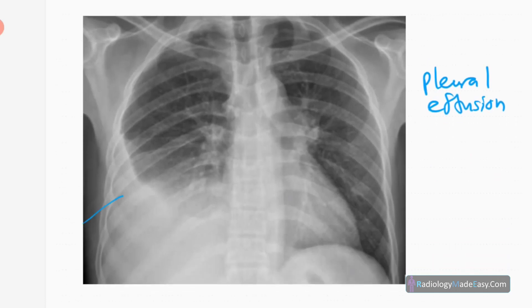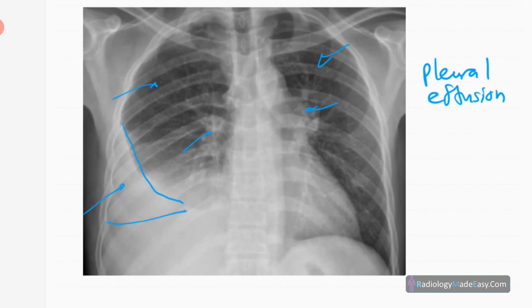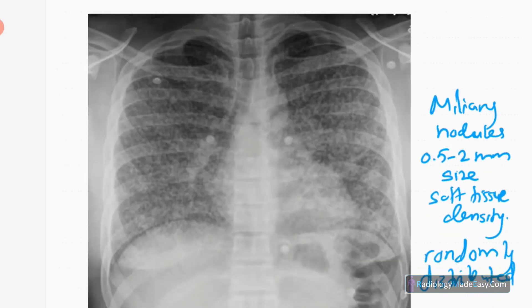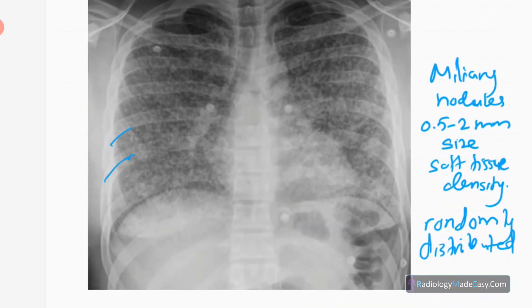Next is pleural effusion. You can see a right-sided pleural effusion with a meniscus-like appearance and an obliterated right costophrenic angle. There are no consolidations, no hilar prominence, no fibrosis, and no cavity formation. This is a simple pleural effusion, probably due to pleural-based TB, as pleural TB can cause pleural effusions.